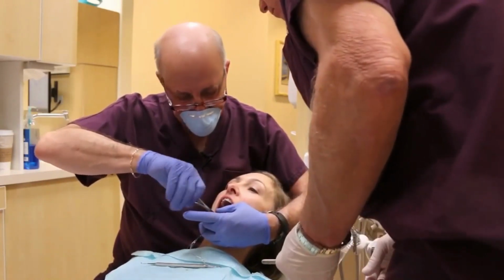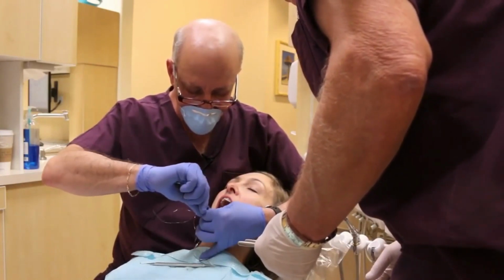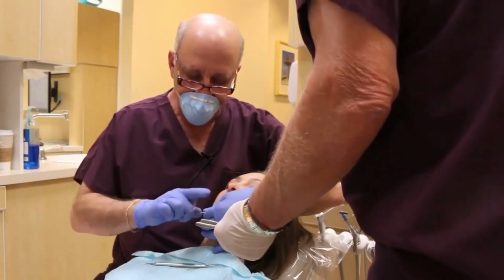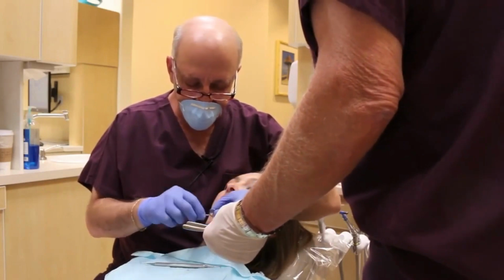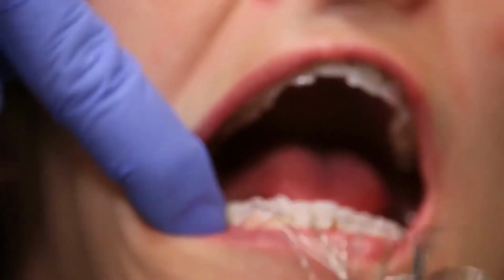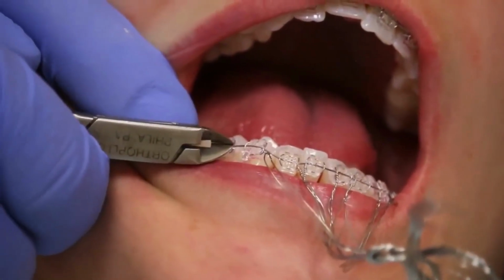But if you like to secure all the brackets, just like I did right now with these last two brackets, and then tie the rest of the teeth, that is also okay. We make sure that we have all of the wires together so we don't have wires all over the place. You know, we put them on a little bow and then turn away from me. You can cut and push.